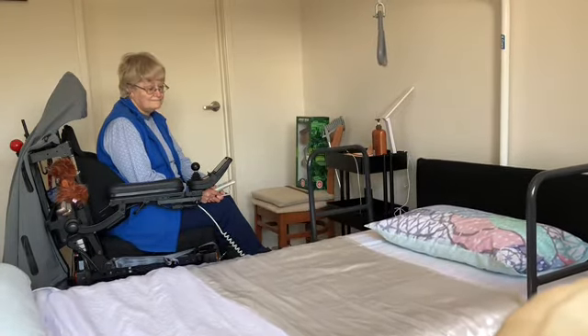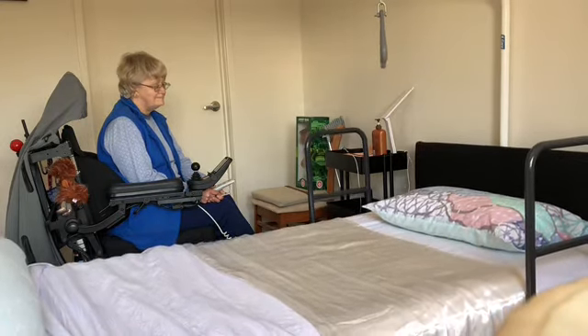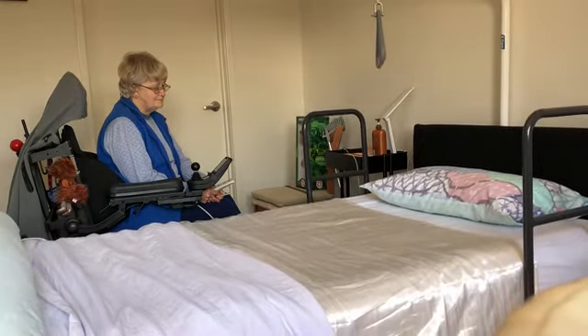I've also got grab rails on both sides of the bed, and this helps me with turning over because I now have some difficulty turning over in bed.